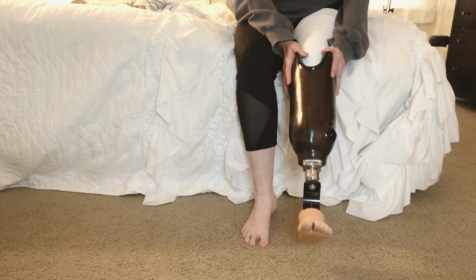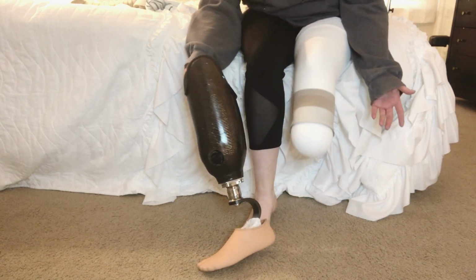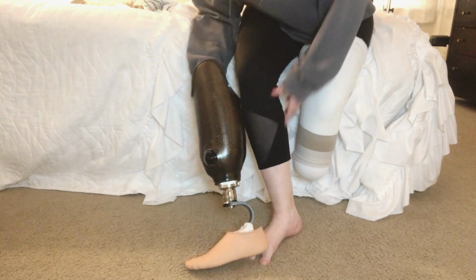It's farting the whole way to the bed. See, I can literally... Where'd you go? I can literally take my leg off without even unscrewing the valve. That's not good. That means I don't have any suction at all.